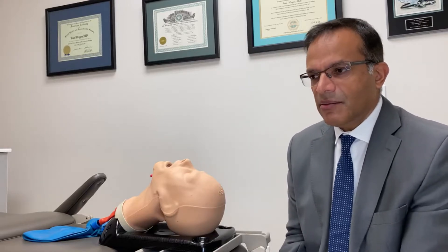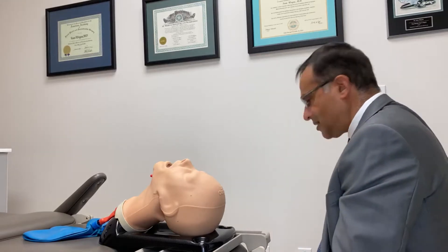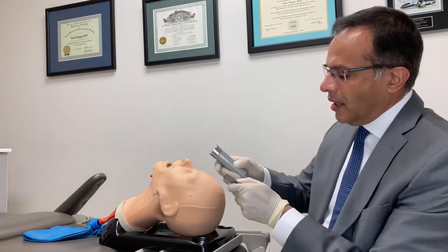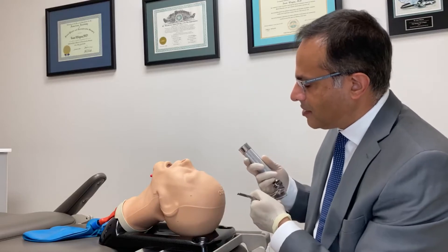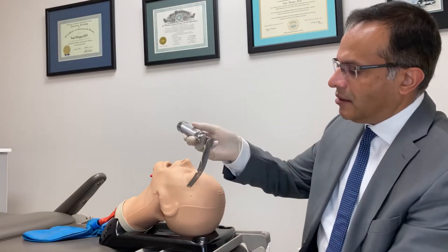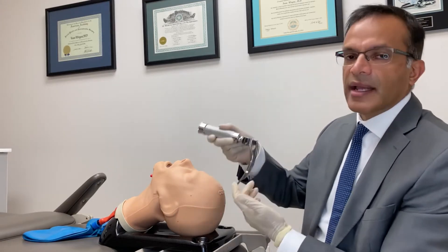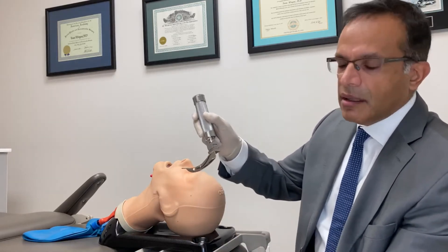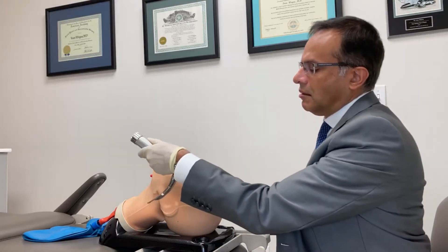Let's go back a bit and talk about the differences between what we use to secure the airway versus how anesthesia uses the Macintosh blade. The camera is on the left side of this mannequin head, but when using a laryngoscope such as a Macintosh, you're using it mainly through the right side of the mouth. It's quite a high profile and it's metal.